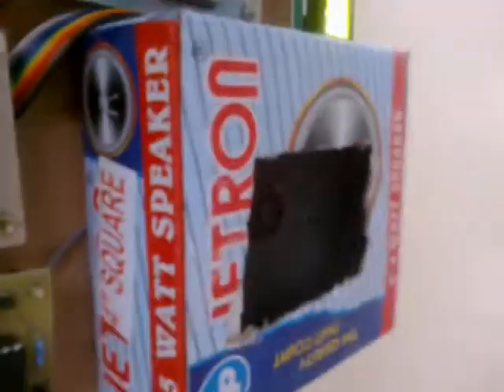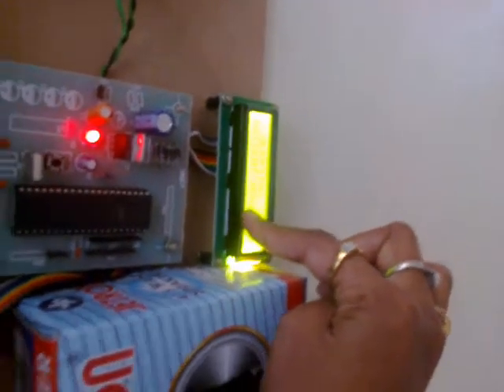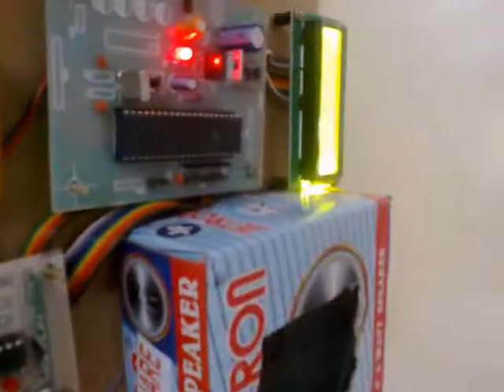Now, after this, the voices are heard with the help of the speaker, and the information is displayed using the LCD. Now, when there's a movement in his hand, the sensor detects the movement and tells us that the particular patient's movement is there in the particular part or region.